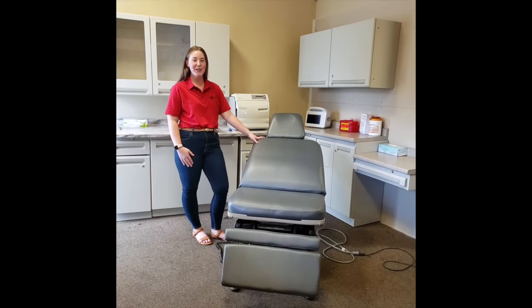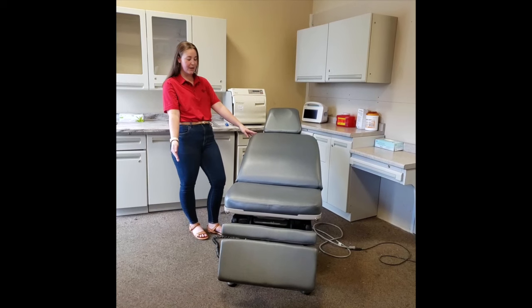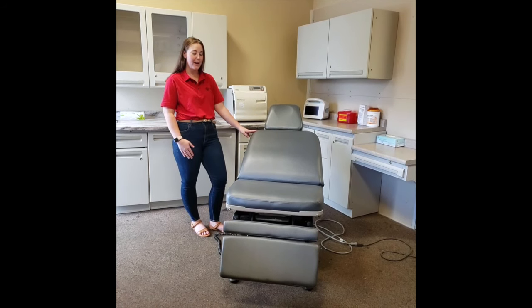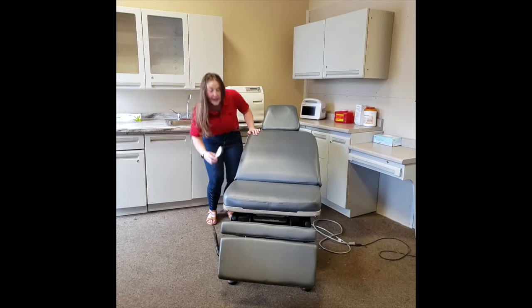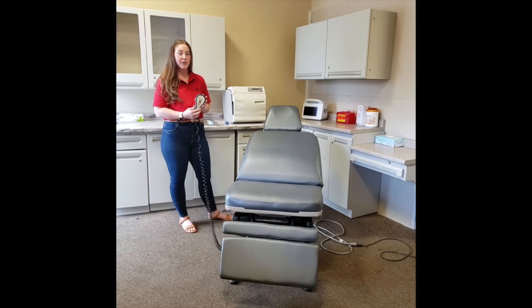Hello, today I'm going to be demonstrating to you the functions of the Midmark 75L Chair. To start, we have our handheld device that will control the chair's functions.